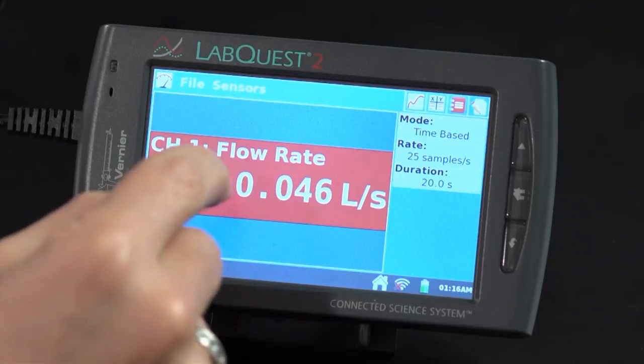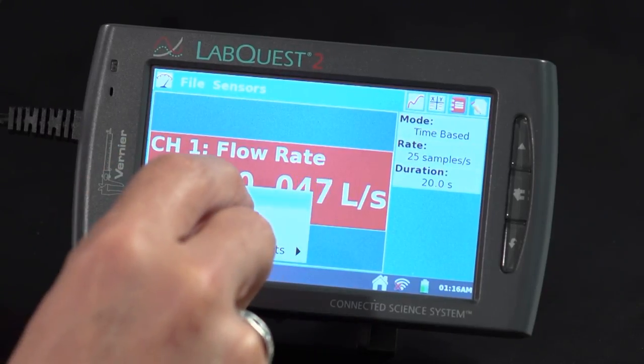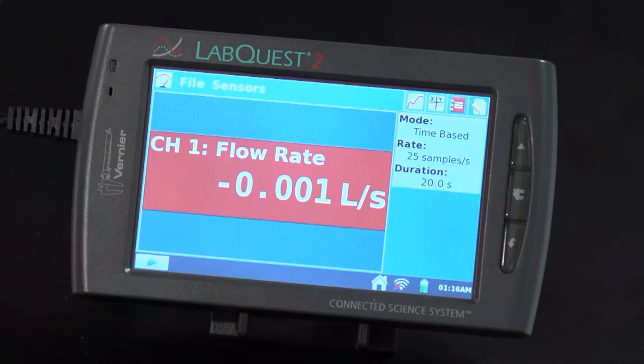And to zero the spirometer, all that I need to do is just tap on the meter screen. I should just be able to select a zero right there. And now you should see that the flow rate is very close to zero. It's fluctuating between minus 0.002 and 0.01, which is effectively zero.